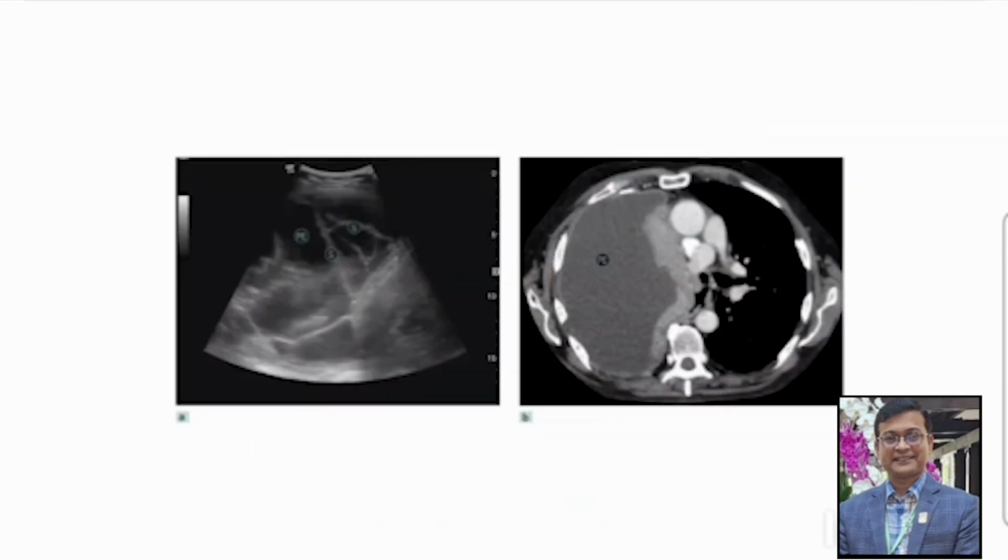The second picture you see is another chest X-ray, chest sonography and CT scan of the chest. Here there is a marked pleural effusion on the right hemithorax, but when you do the ultrasonography of this patient, there is an extensive septation, pleural thickening and loculated effusion. So if anyone jumps to do the pleurocentesis just seeing the X-ray or CT scan, it is certain that he may miss the pleural fluid aspiration. So this is the strength of pleural ultrasonography, to get a real-time picture to do the diagnosis and the intervention.